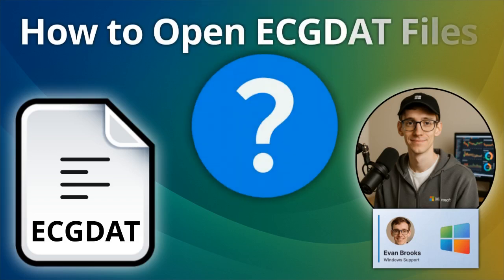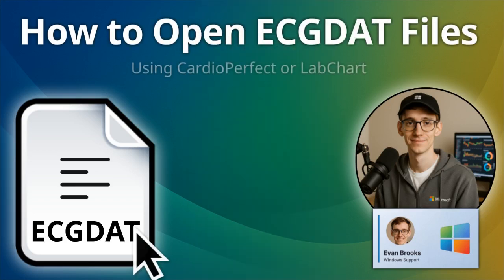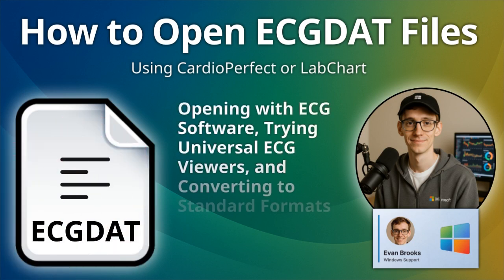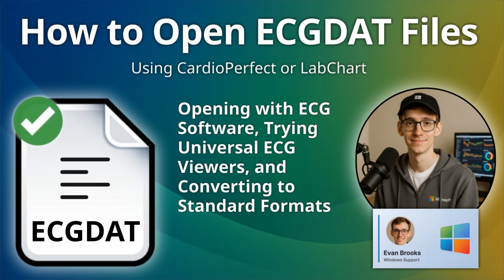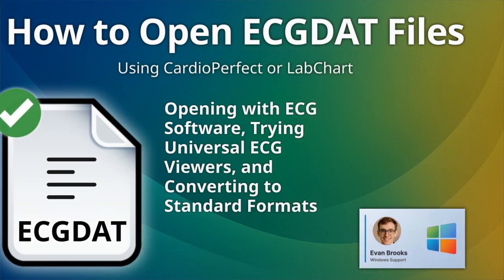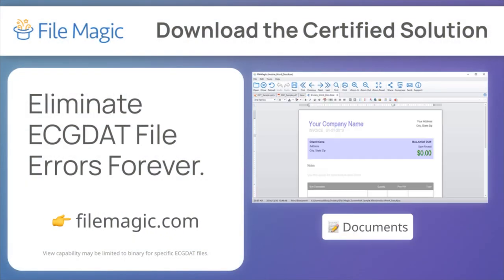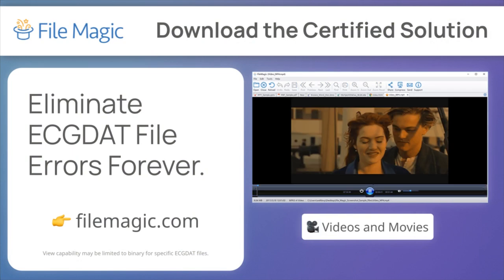Received an ECGDAT file from a medical device or cardiology study and need to view the heart rhythm data? These files contain critical electrocardiogram recordings. I'm Evan Brooks, Certified Support Engineer, and I'll show you how to access ECG data files properly. We're tackling this ECGDAT file systematically, and I've reserved the most powerful data extraction technique for the end, just in case.